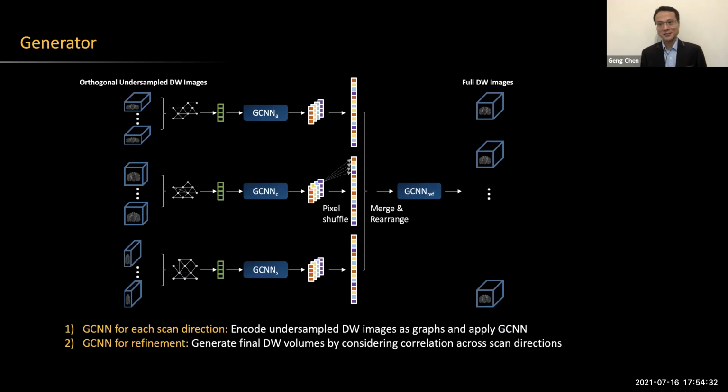Okay, thank you for the question. So basically the input of the graph neural network is actually a patch. Because for the whole set of diffusion weighted volumes, it is very large. So basically, we extract blocks from the diffusion weighted volumes to construct the corresponding graph and represent the blocks as graph structured data, so that we are able to feed the graph structured diffusion MRI patches to the graph convolutional neural networks for certain tasks. Here the input is actually extracted blocks from the diffusion MRI data.